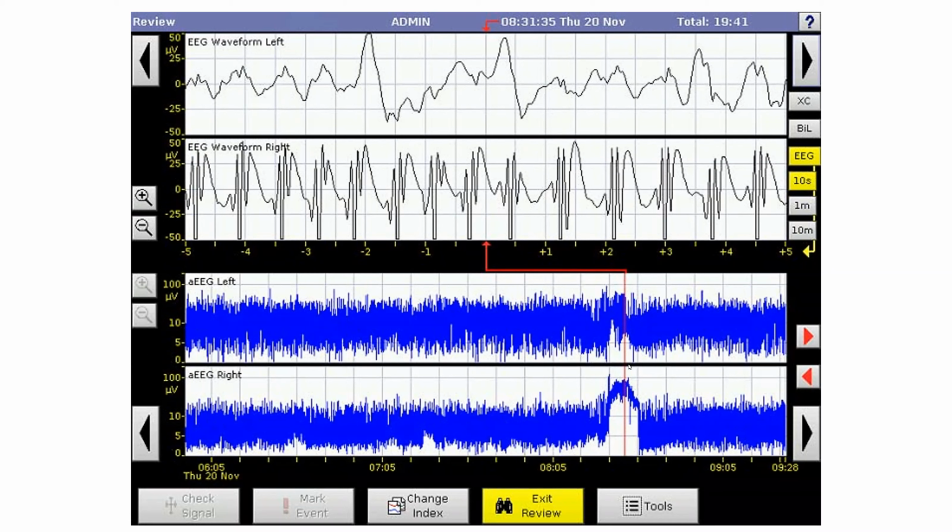And then of course, when we come in with our markers and our cursors and we decompress the EEG that formed that aEEG, we're looking for the presence or the absence of artifact. What do we see? Do we see movement? Do we see padding? Do we see muscle? Do we see a spike and a wave, a spike and a wave? Just like we see here, some very rapid spikes and then a slow wave, as the brain recovers. And we're looking for the rhythmic pattern.